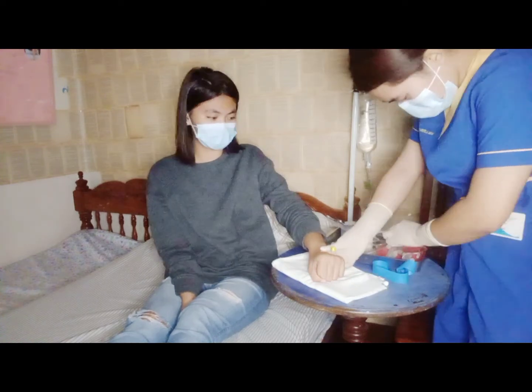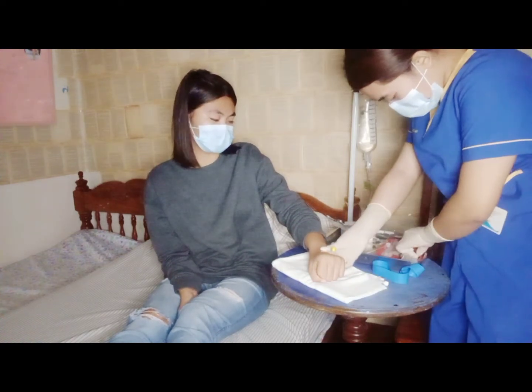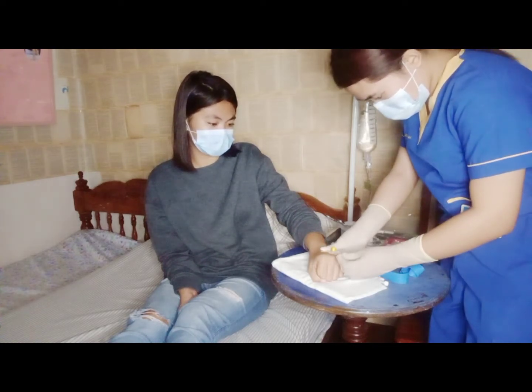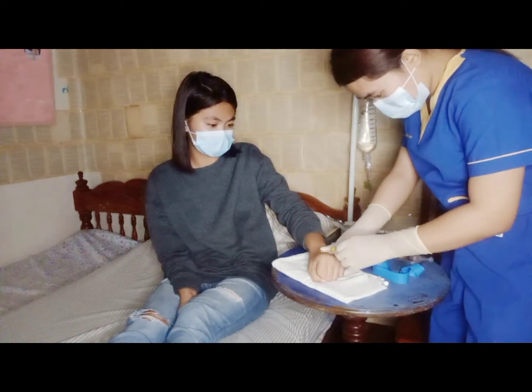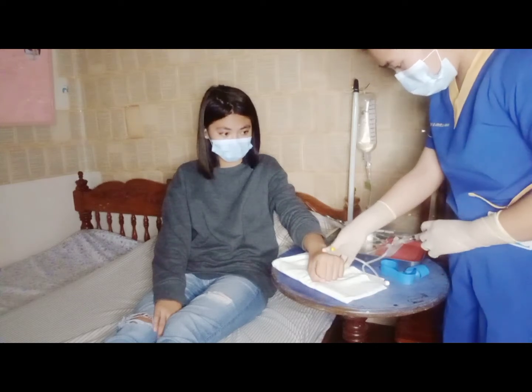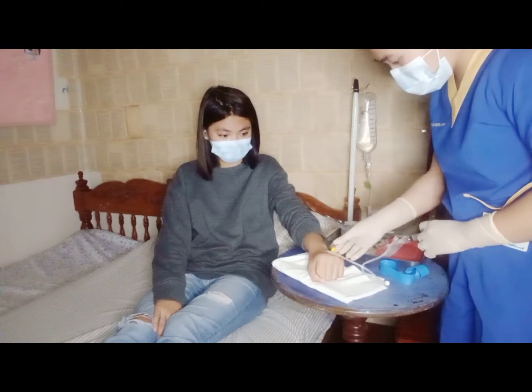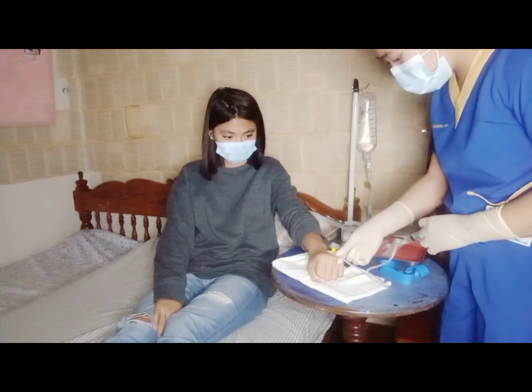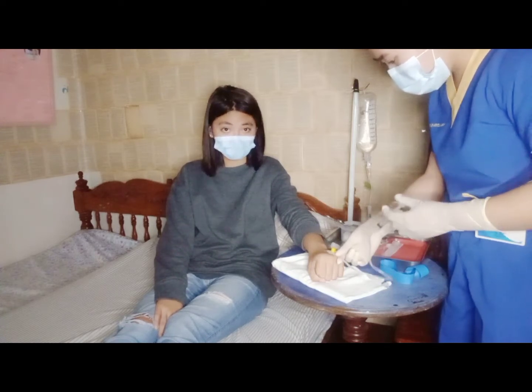So, let's attach the extension tubing. Then we will flush. And, of course, observe for the leaking and the infiltration.